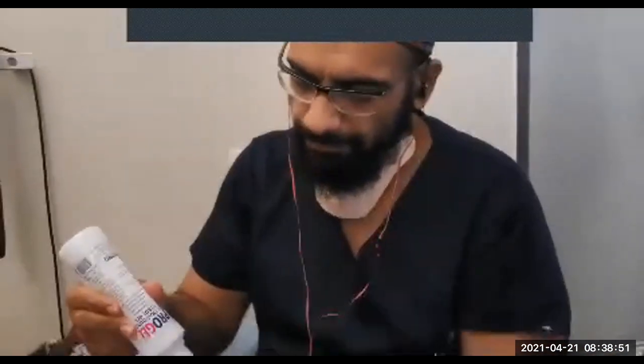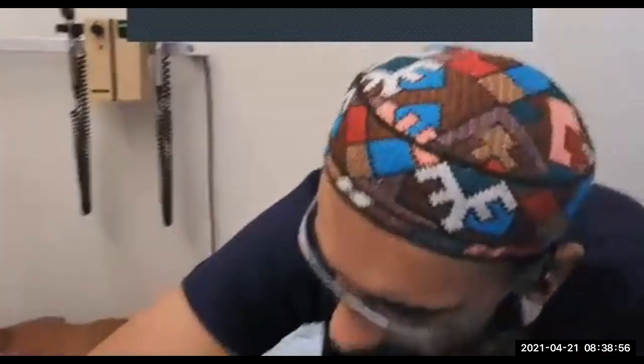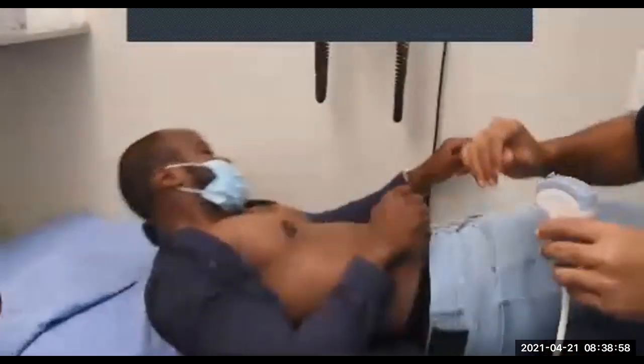Now let's say we want to see the whole heart. The last thing we're going to look at is the apical view. In that case, we ask our patient to turn onto the left-hand side. So Melissa, if you can turn onto your left side for me. What this does is move the heart anteriorly, just a little bit more. So you're going to lie on your left side and come a bit more towards this side. Sorry, I won't let you fall, don't worry.